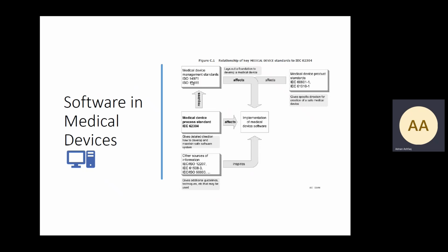And it implies here you have ISO 14971, ISO 13485, which is the cornerstone of quality management system, 14971, which is the risk management standard. Depending on the nature of the device, if there are electromechanical, electrical safety required, then 60601, 61010. And then also some of these other standards, which also could involve cybersecurity and other areas which are required for the implementation of medical device software.